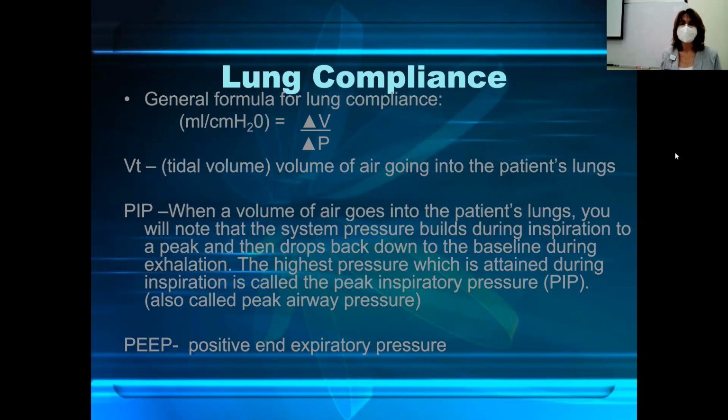So the pressure that builds when we put the air in is called the peak inspiratory pressure. And then of course, everything in respiratory, it's not good enough that it has a name. It's got to have 2 names or 3 names. Peak inspiratory pressure is also called peak airway pressure. And it means the same thing, just different ways of referring to the pressure that builds during inspiration.